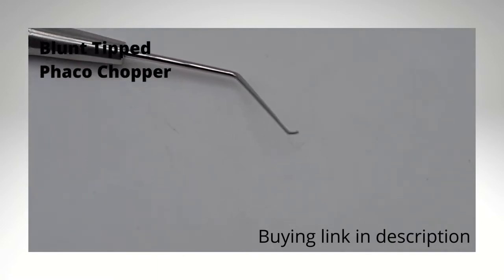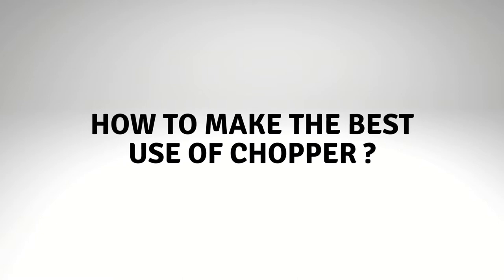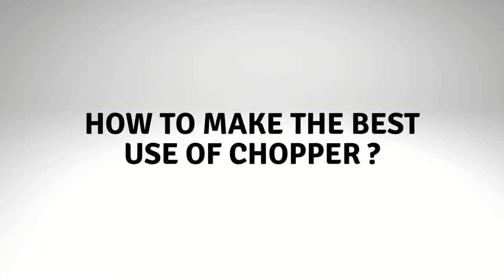The best description of the use of these choppers has been provided by Dr. Brian Kim. Stay with us to watch how to make best use of these blunt tip choppers while doing the horizontal chopping.